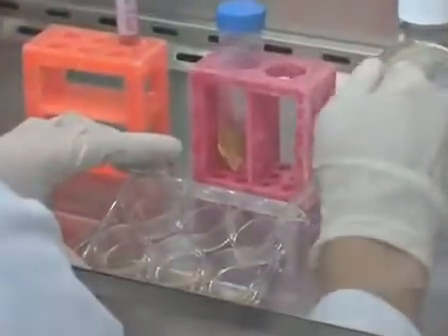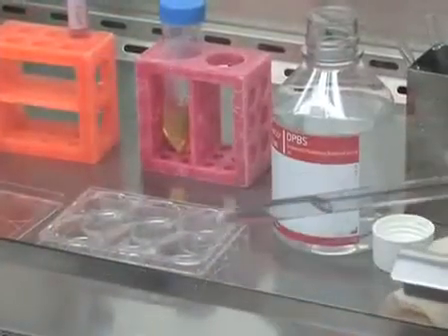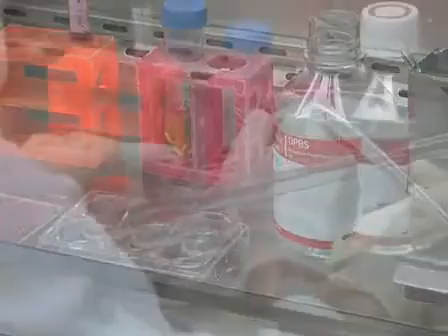On the day of splitting, wash each well that will be split with 1xPBS pH 7.4.